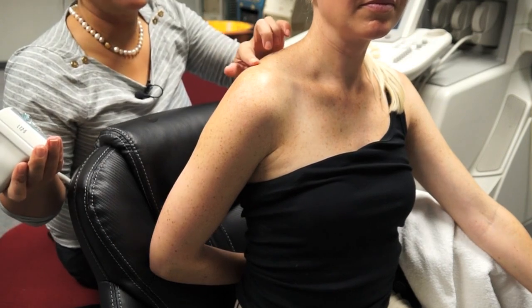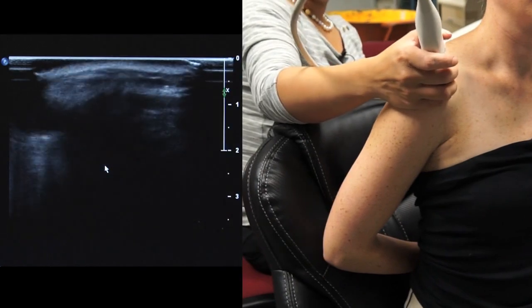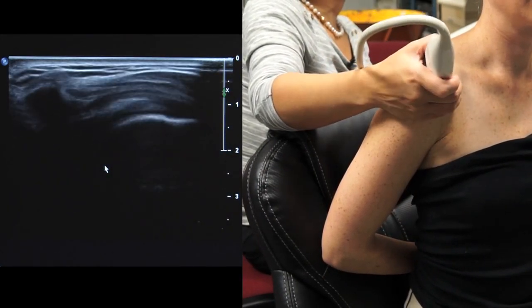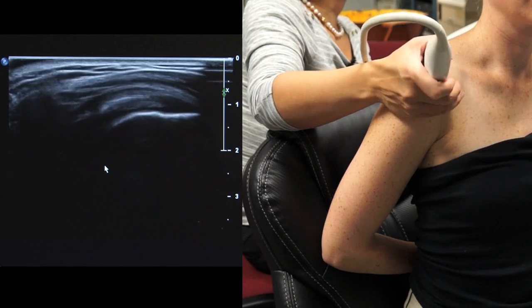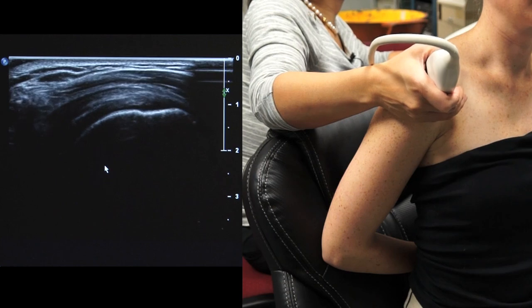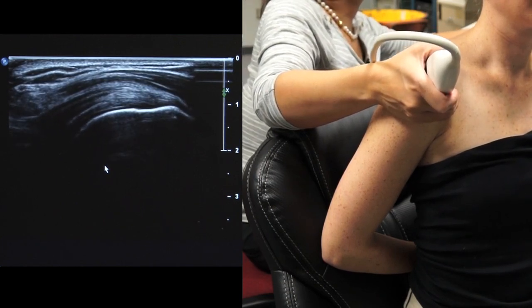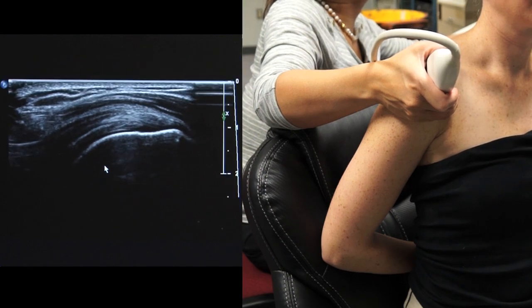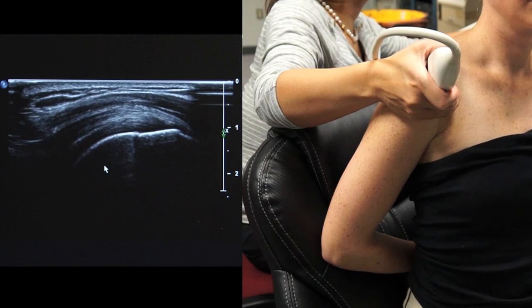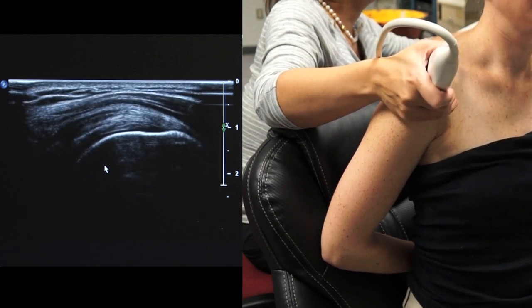Now again, reminding you that the fibers run in this axis. We want the marker of the transducer up. Okay, and here we are getting what they call the bird's beak view of the supraspinatus tendon. I'm going to adjust and decrease the depth. Okay, make sure that the focus is on the structure we are imaging, which is the supraspinatus tendon.